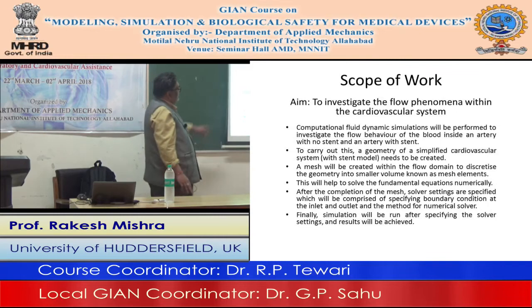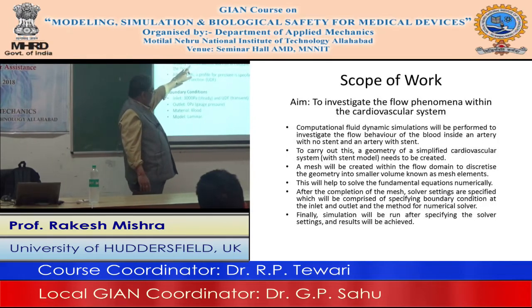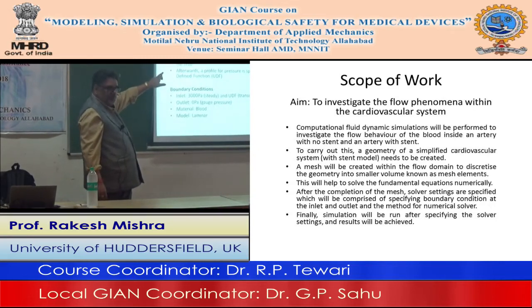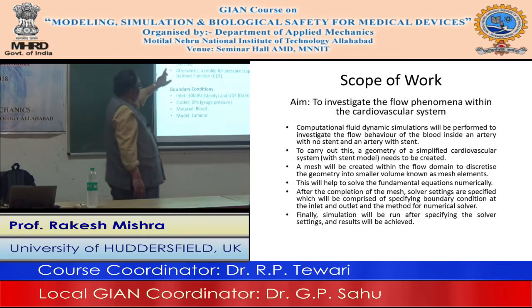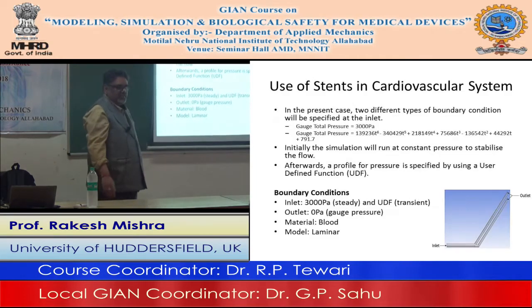And the equation that I have taken for the user-defined function that corresponds to a cardiac cycle is this. We have taken it from reference, and T is the time which dictates how the pressure is changing. So if you put T equal to 0 there, you get a pressure of 791.7 pascals, okay? And then it keeps on increasing, and then it starts to decrease. So we have a pressure cycle that will be implemented here, and we'll see what happens when we have a transient pressure cycle acting on an arterial network.